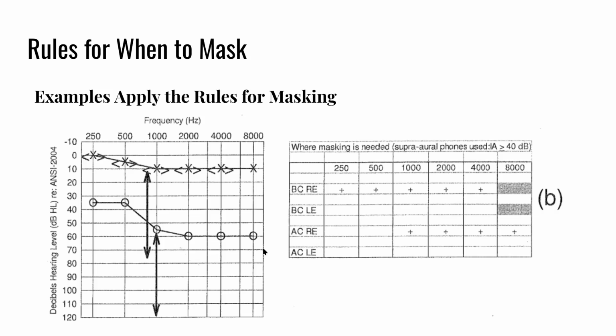If we already had obtained our masked air conduction thresholds in the right ear, then we would have a better idea of what the limits of the masked bone conduction thresholds would be.